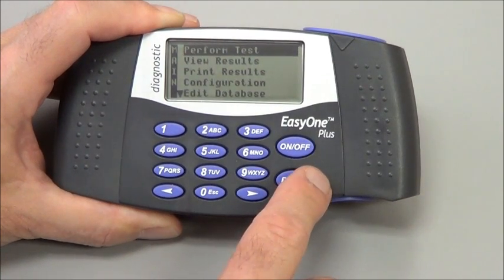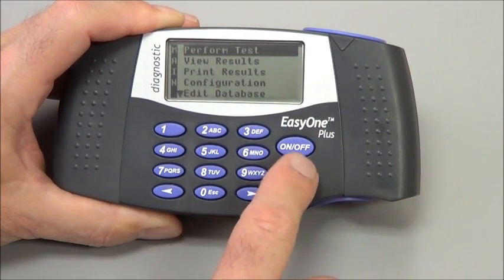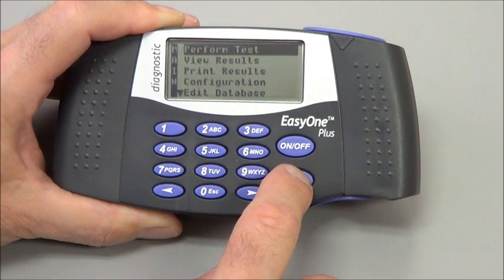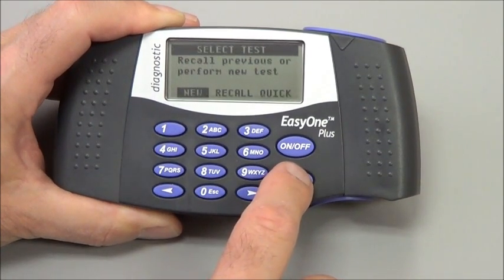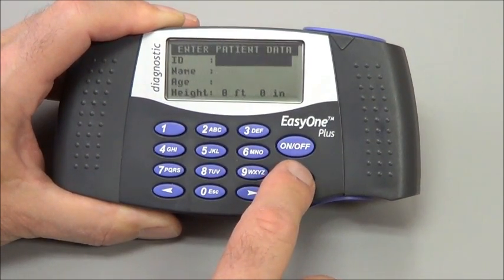Here's how to enter patient data on the Easy One and get ready for a test. From the main menu, press enter on Perform Test, then choose New.